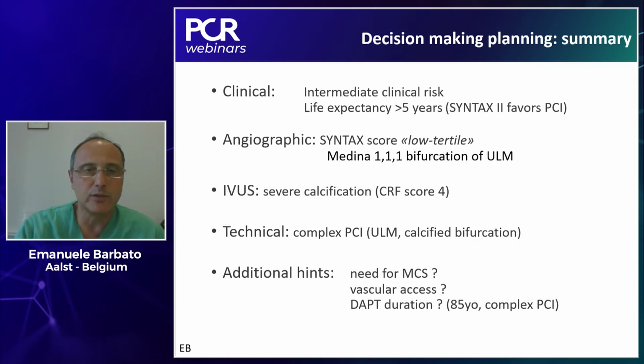And I agree with you, you give it a try. You give it a try. If the IVUS goes, well, then it's already an interesting feedback for you. If IVUS doesn't go, then it might be even tough for a balloon to cross. And here I want to open a discussion because we already know that this is a heavily calcified lesion.